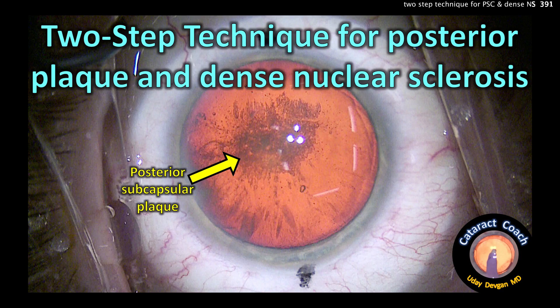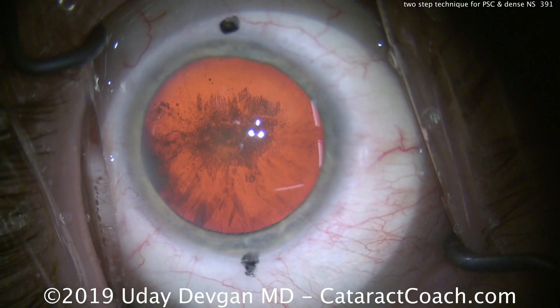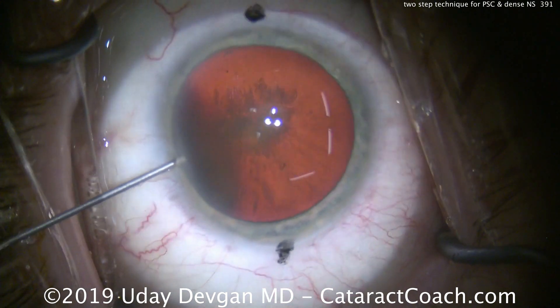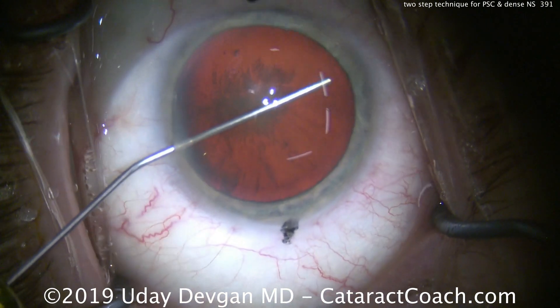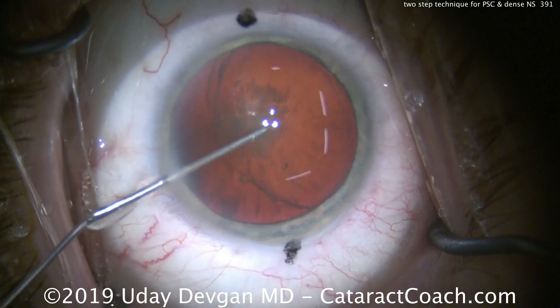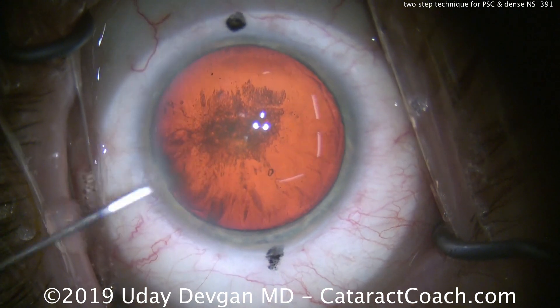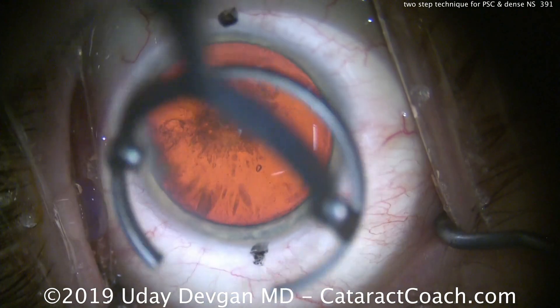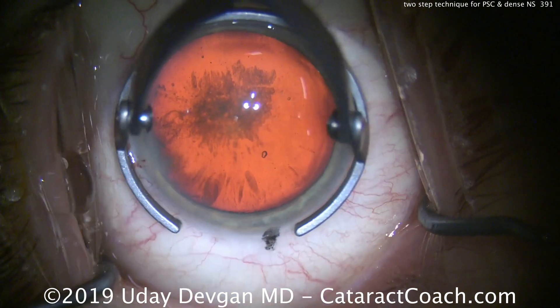CataractCoach.com. We have a two-step technique for posterior plaque and a dense nuclear sclerotic cataract — a cataract with a combination of both types of changes. Centrally, there's a very dense central granular posterior subcapsular cataract and plaque formation, so dense that it prevented us from doing an optical coherence biometry.